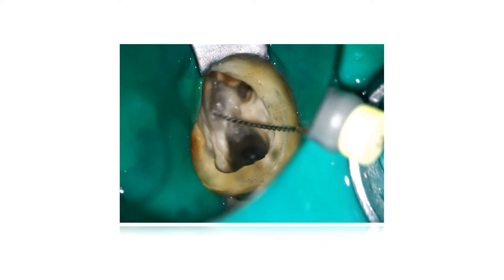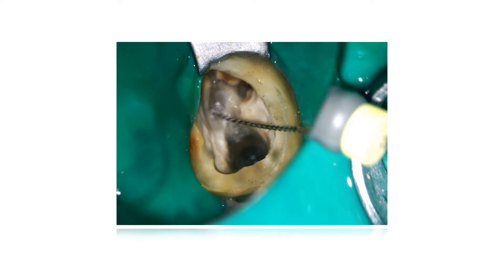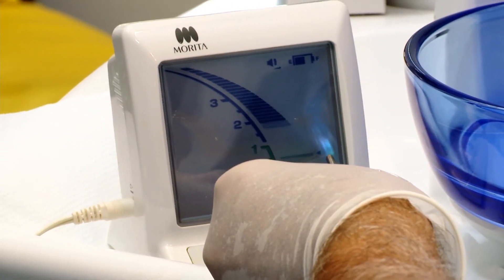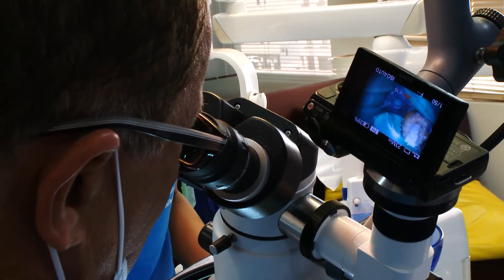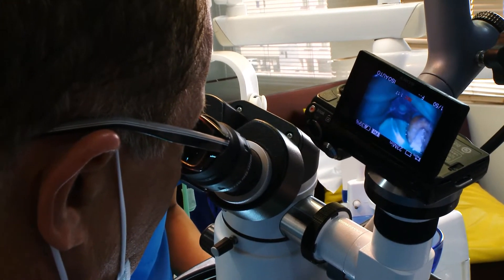As you can see, under the microscope the operator is able to permanently control the cleanliness of the inside of the tooth, the removal of all infected tissue, and all remnants of the previous procedure.